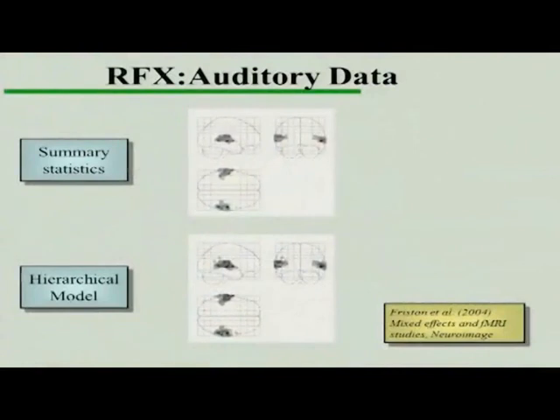And we can use that function to do mixed effects analysis, and it's actually implemented in SPM. It's called SPM_MFX, and here's the output of that analysis procedure on some auditory data.